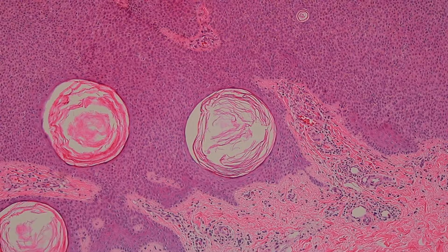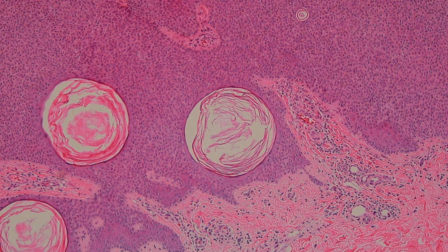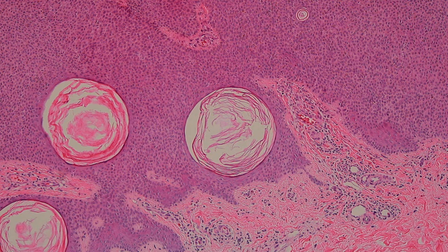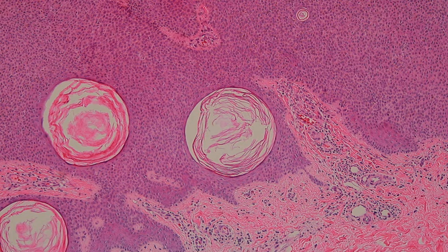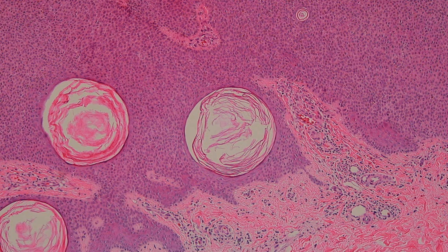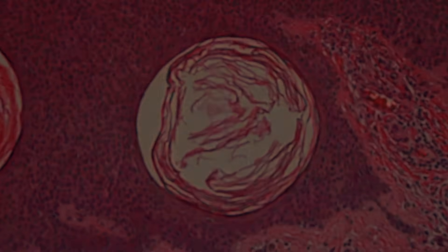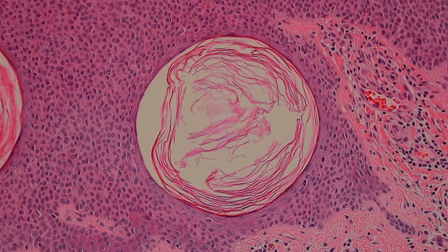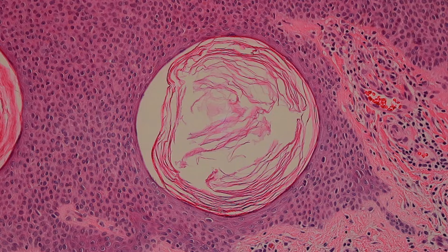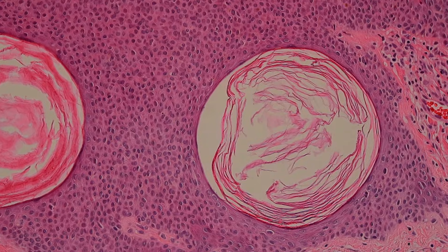Horn pseudocysts are within the seborrheic keratosis, which means they're usually sitting within the epidermis. Occasionally that can be hard to tell because seborrheic keratosis can be so thick. They're made usually of swirly, loose, flaky keratin. See how loose and delicate the keratin is? It's usually orthokeratin — meaning it lacks nuclei. It doesn't have retained nuclei like parakeratosis would. I'll show you the contrast in a minute when we look at keratin pearls.